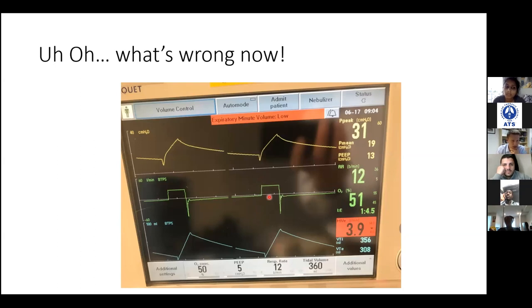There are some situations where patients are dyssynchronous, and that's beyond the scope of this discussion, where changing the flow to longer or shorter can help with the patient dyssynchrony. But certainly, you will play with the flow quite a bit in your fellowship.